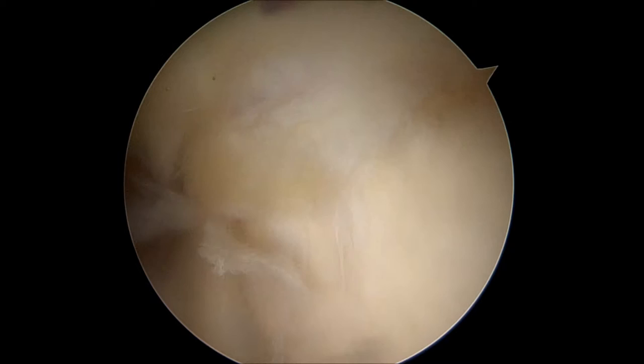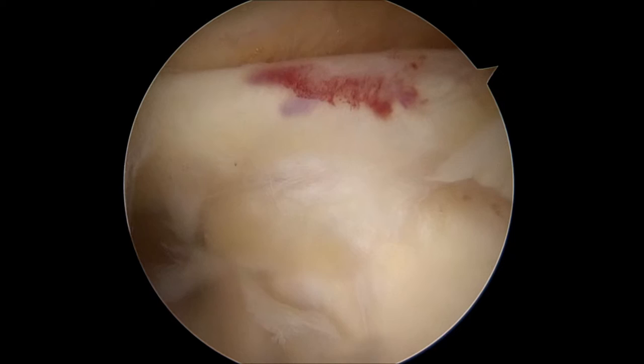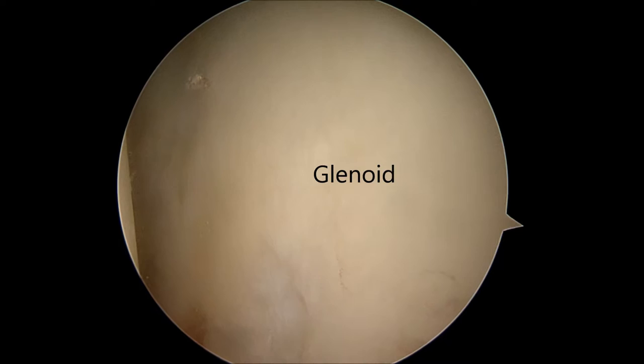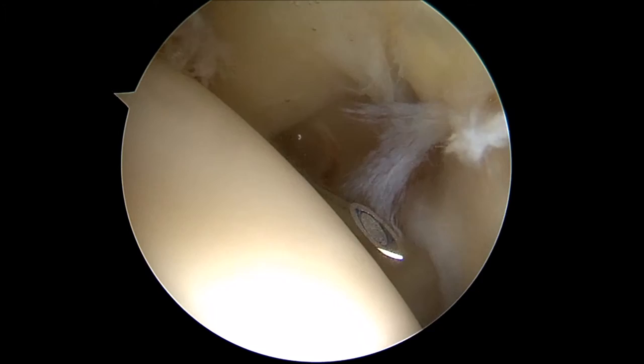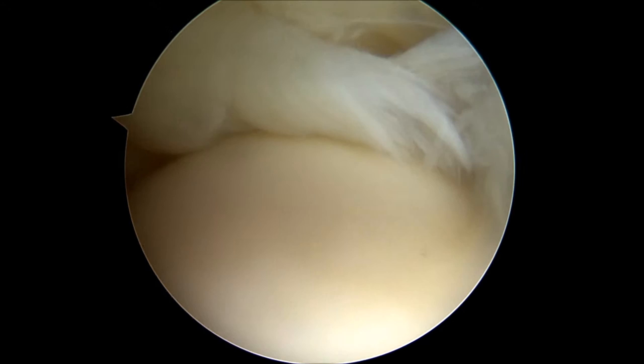Arthroscopic rotator cuff repair surgery begins in the joint space. First, the top of the labrum is seen. Below that, the glenoid socket can be seen. Next to the glenoid socket is the humeral head, or the ball of the ball and socket joint. In the front of the shoulder, the normal subscapularis tendon can be seen. On top of the humeral head, you can see significant fraying in the area of the supraspinatus tendon attachment site. This is the rotator cuff tear in this video.